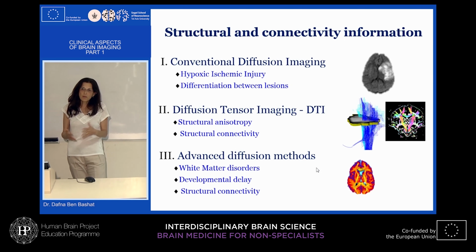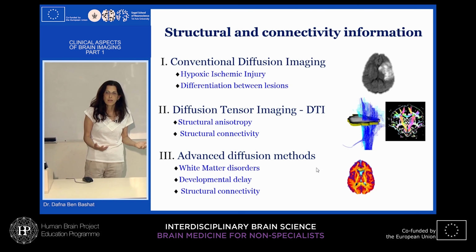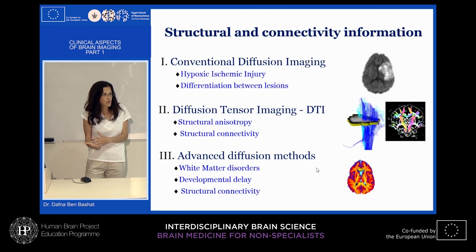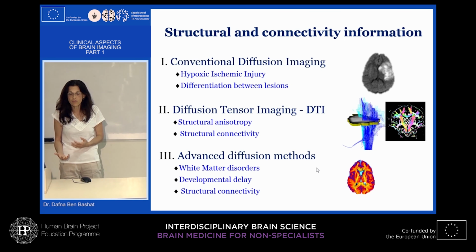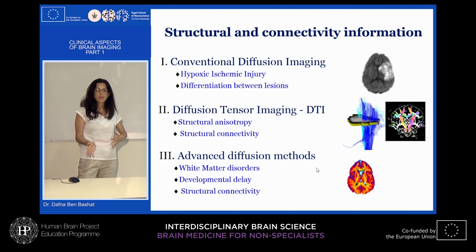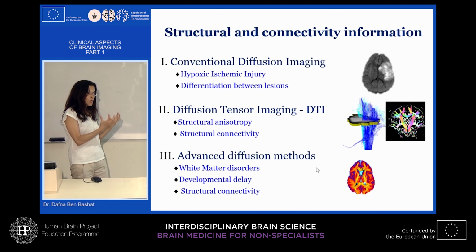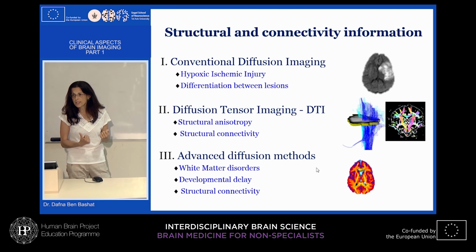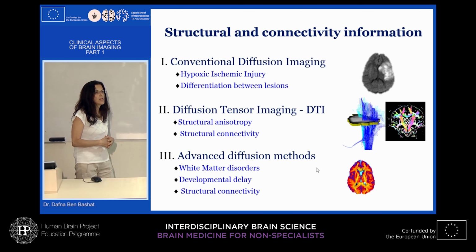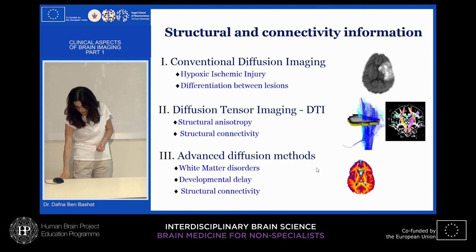If somebody develops a beautiful method but it takes 40 minutes to acquire, it's a problem, because MRI is already long: with 6, 7, 8 contrasts at about 2 to 3 minutes each, the patient already has an exam of 30 to 40 minutes. So there's always a gap between what we develop and translating it to clinical use; it either has to be really valuable or it should be shortened.